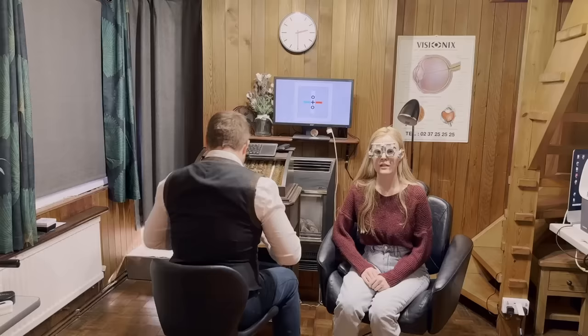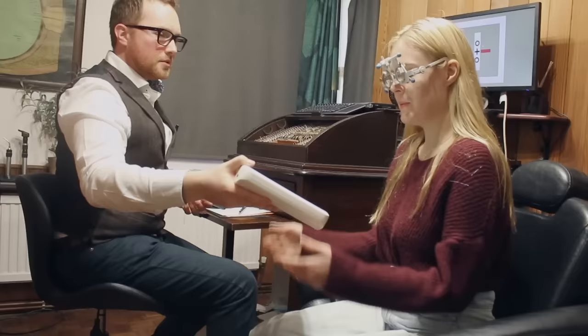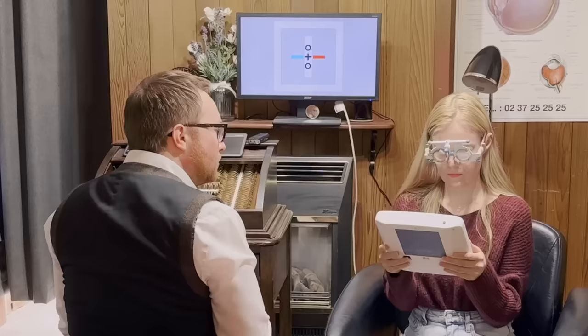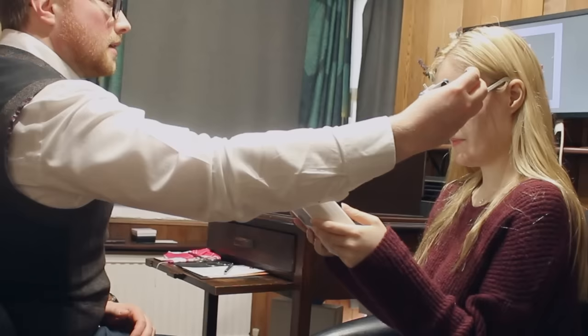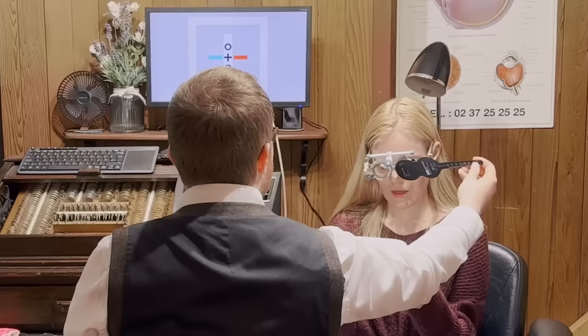Right. So the next thing we're going to do is have a look at your close-up vision. So just hold it that way, how you tend to hold a book or something to read. And then if we have a look at the clarity, so we've got some paragraphs here. Now, these small ones, how's the N5 paragraph looking at the moment? Yeah, it's perfect. Yeah, nice and clear. If I were to cover one eye up, can you still get the text in that paragraph? Is it still clear and comfortable to read? Yeah, it is. And with the other eye up?